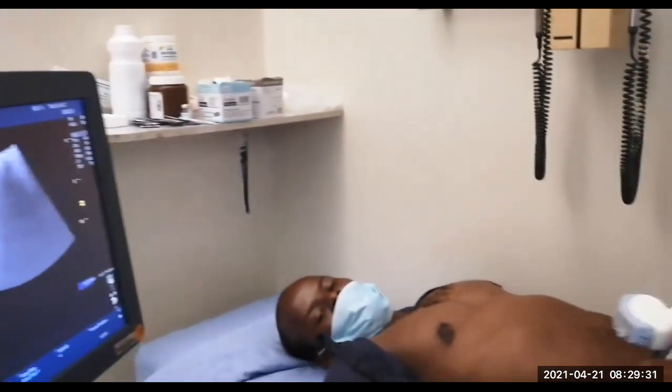Now, we are not echo technicians. That takes months of training, actually. It's about actually 2 years of training, sorry. So what we're trying to do is just see if we are in an emergency department setting, what are we going to look at? So this is just a revision and to introduce you guys to the two other views that we use, all right?